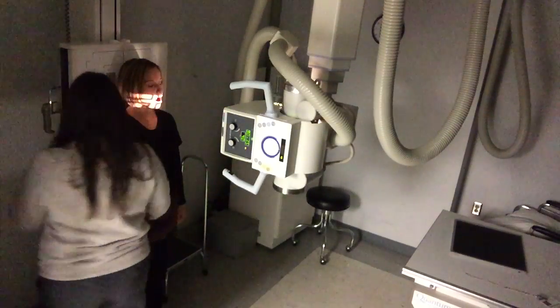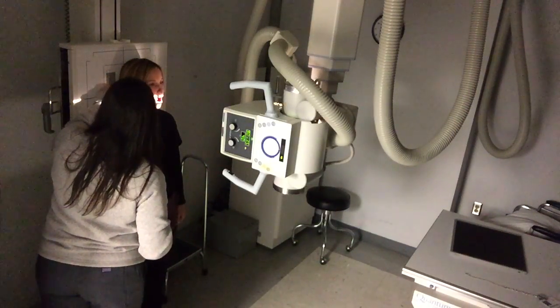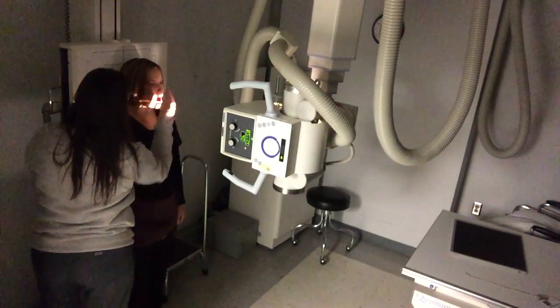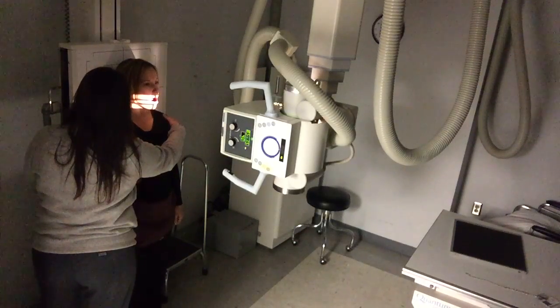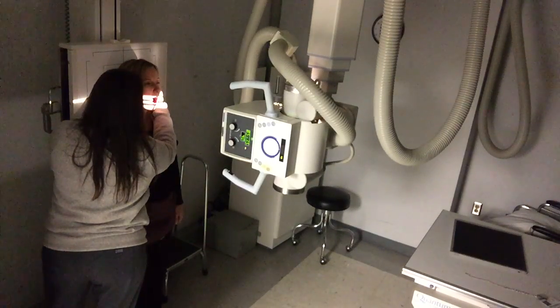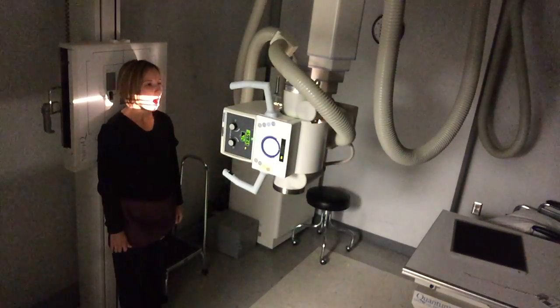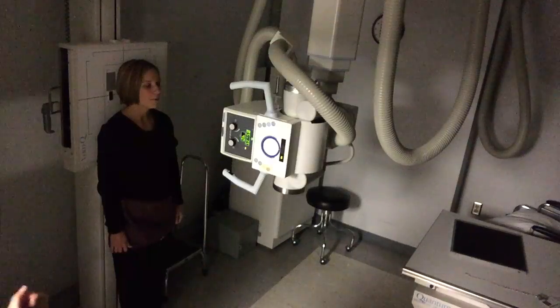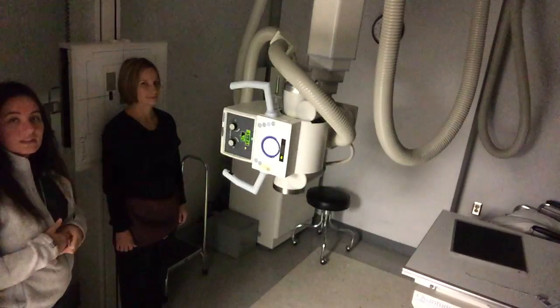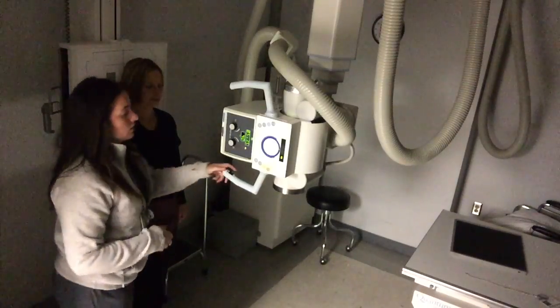I'm going to add a marker — you can mark either side, right or left. I'm going to scoot her so that the center line is right down her nose. Now that I've got her where I want her, I'm going to tell her to open her mouth as wide as she can, maintain that orientation, then walk back and set 85 KVP and expose. That's a difficult position to hold, so wait until the last minute — otherwise they will move their head out of comfort.